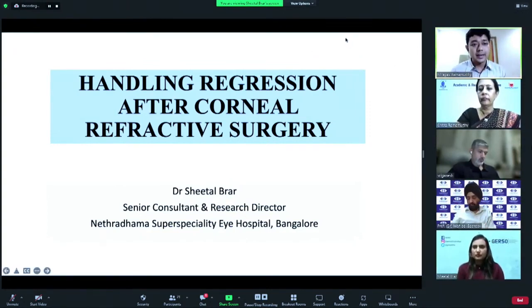So early moderate keratoconus, that is becoming the treatment of choice because the outcomes are far more predictable with a topography guided treatment than you have with an intracorneal ring segment. Having said that, it is still a useful device in that segment of patients where, like I mentioned, with the preoperative characteristics, you can definitely use an intracorneal ring segment, improve the quality of vision, and then go ahead and do other refractive procedures to further improve that vision.